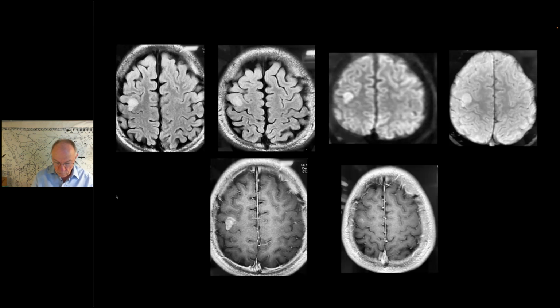So Nihaal, do you want to go through? Yeah. So here the MRI, I think. At what age was this done, Dr. Vivek? Is this a recent one? So this one was the last one, around 14 years of age. In the last 1 year only, all the MRIs, everything in the last 8 months.